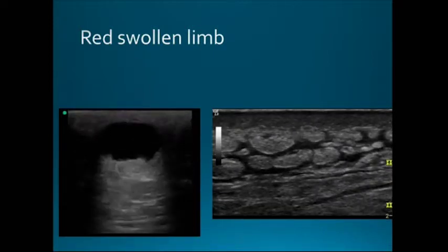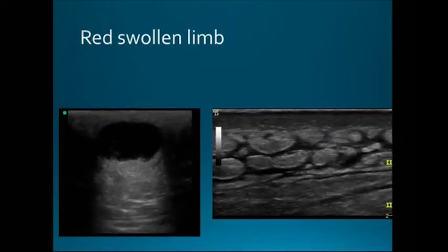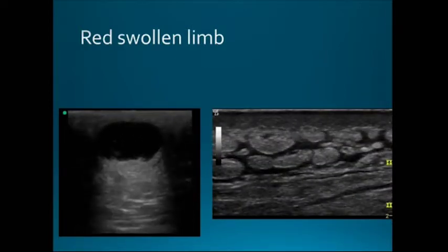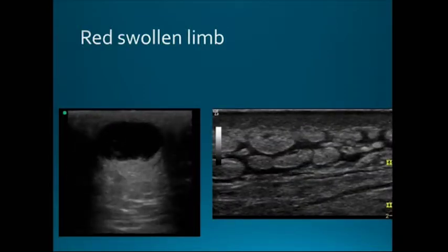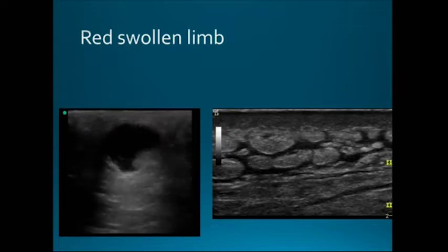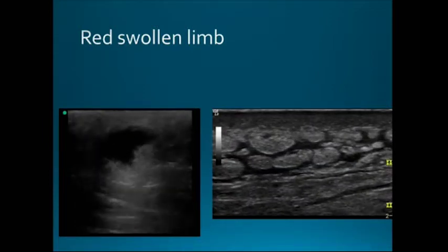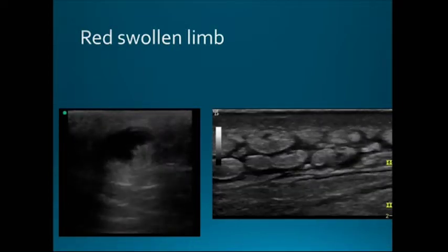When they have cellulitis, you get a lot of swelling all over, and there's no clear collection of fluid. There's a lot of fluid in the tissue, and that's what causes all that edema. But there's no collection. This is what we call cobblestoning, and you can see this with edema, but you can also see this with cellulitis. This helps you distinguish the person who does or does not have an abscess.